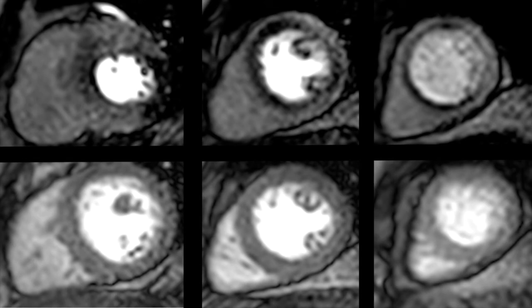Representative images of the stress perfusion demonstrate areas of hypoperfusion along the basal infralateral segment with no corresponding rest perfusion defect. In the mid cavity, you can see the anterior, inferior, as well as the septal segments have a perfusion defect with no corresponding defect in the rest images.